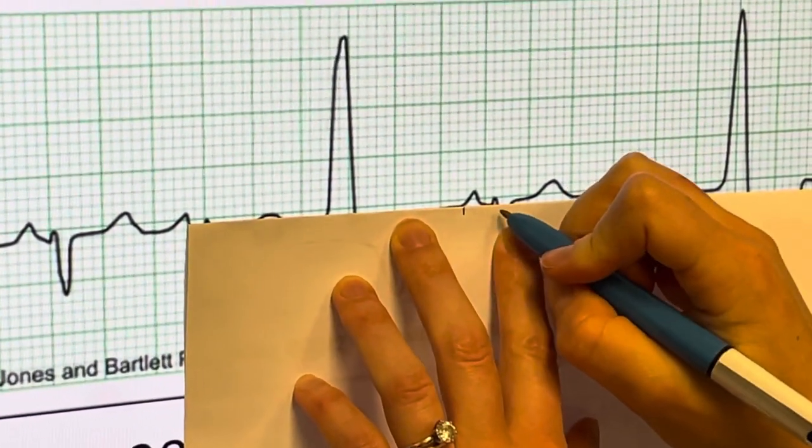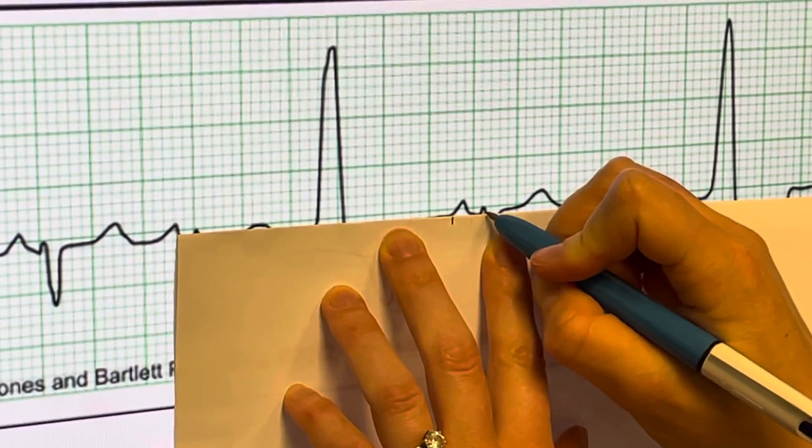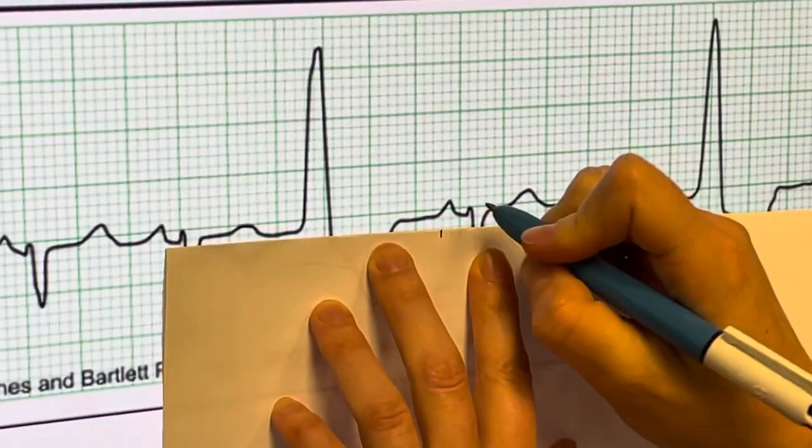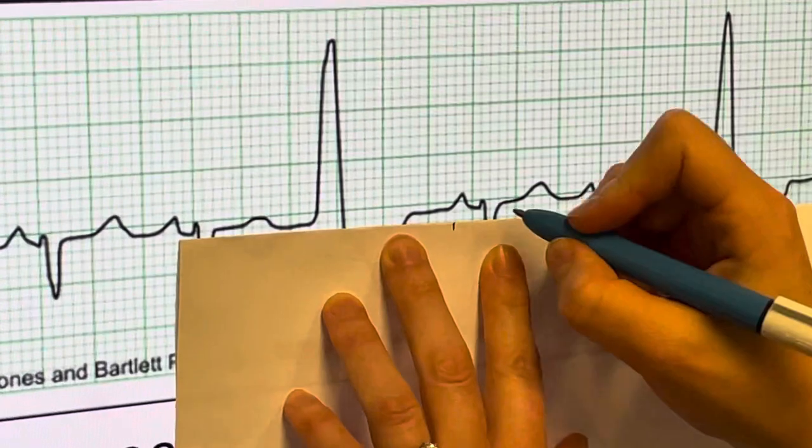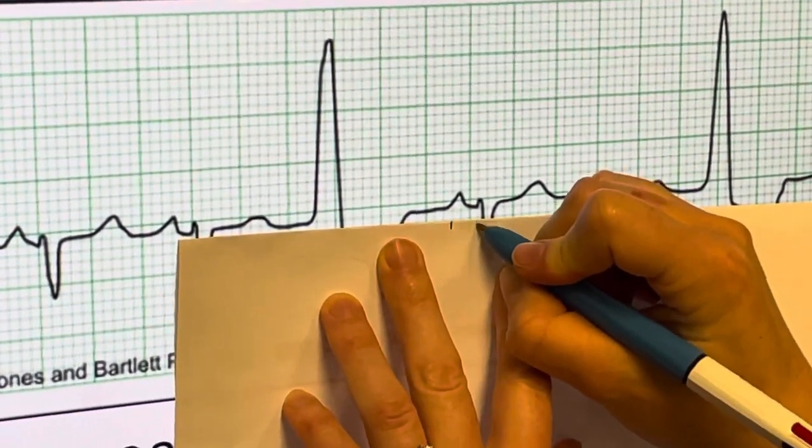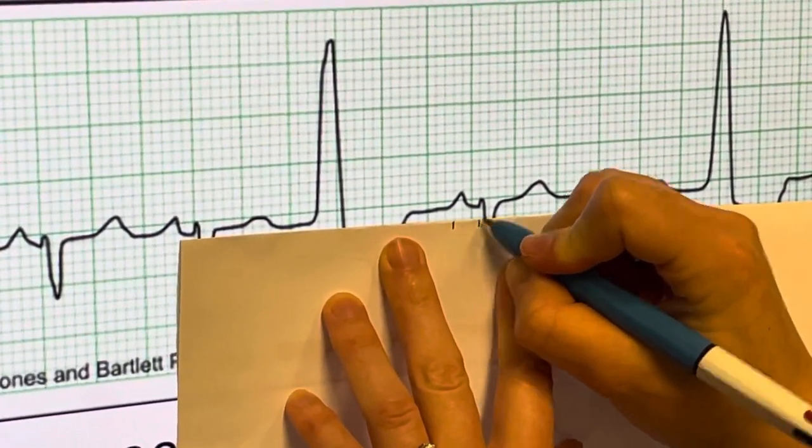I'm going to end my PR interval when the baseline comes up into the QRS complex. Right here, I can see I'm coming up into the QRS complex. I'll draw a line down there to symbolize the end of the PR interval.